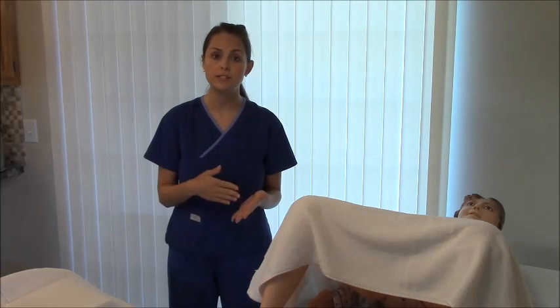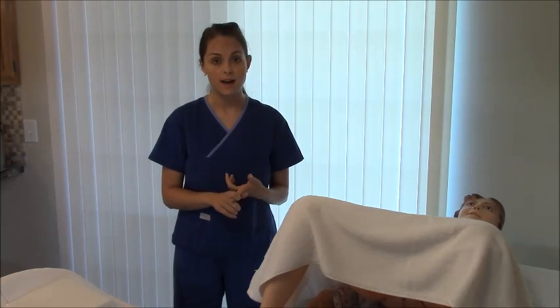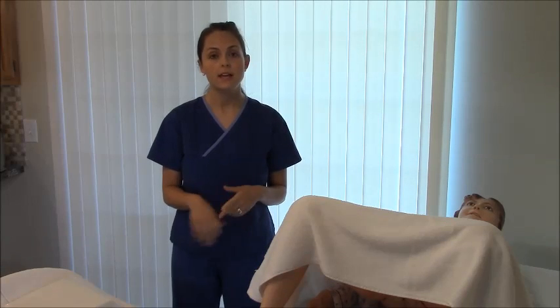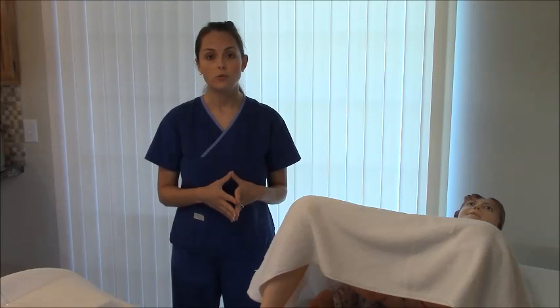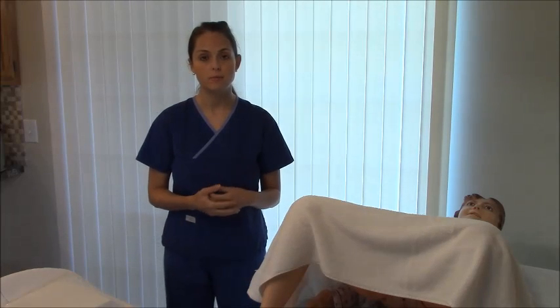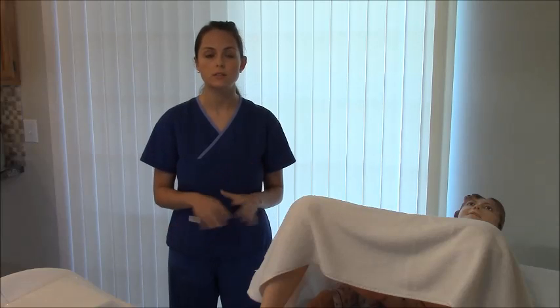Next, address their allergies. The kit contains betadine, and a lot of patients are allergic to it, so you'll need to get another prep agent if that's the case. This kit also contains some latex, so make sure your patient isn't allergic. If they are, find out what type of reaction — is it severe, moderate, or minor? You'll want to evaluate that carefully.